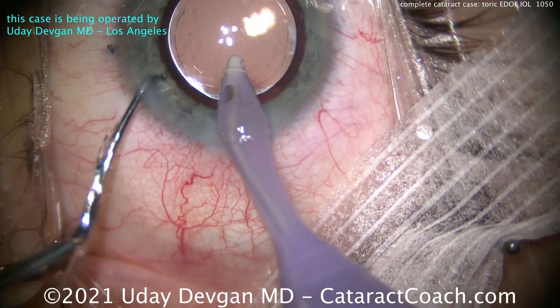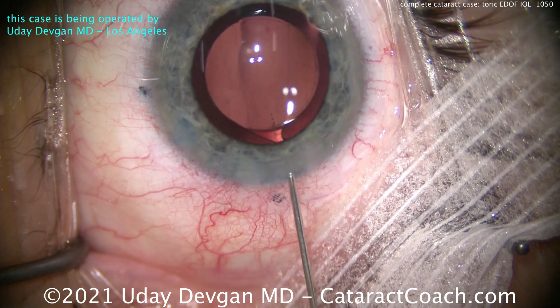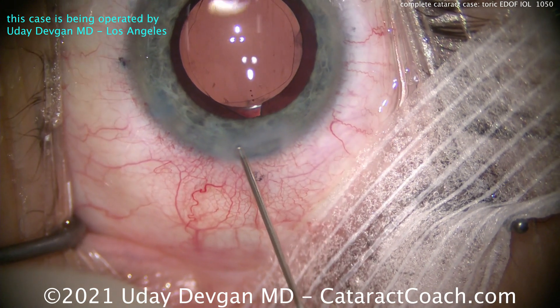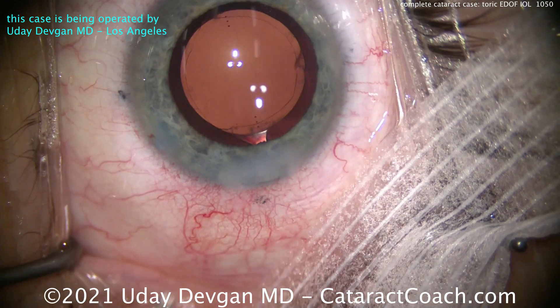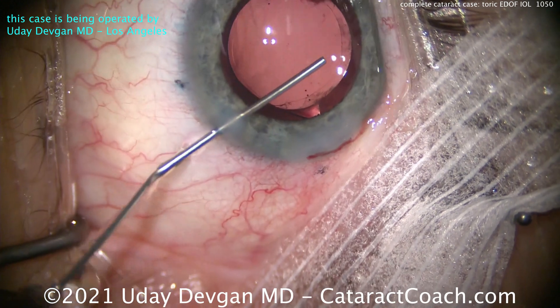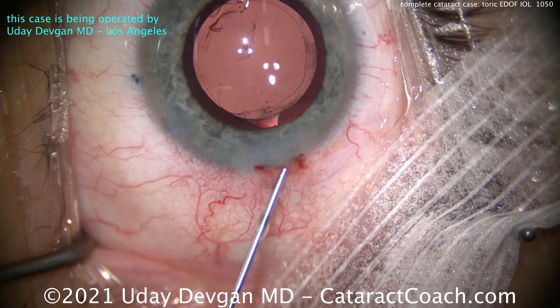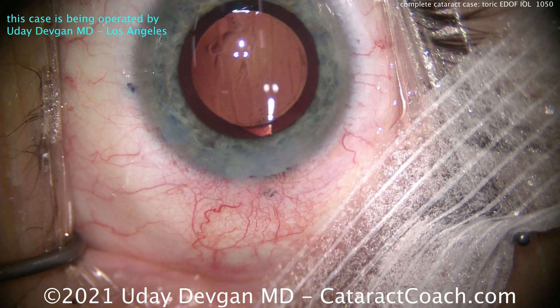We have marks on the cornea to show us the exact steep axis. You can see the Purkinje images in the center — those reflections, those three dots in two sets — that's the first and fourth Purkinje images. When we line those up, they should be right in the center of the central part of the optic. We're going through the side port, washing out a little bit of extra viscoelastic, getting this just clean the way we want it.